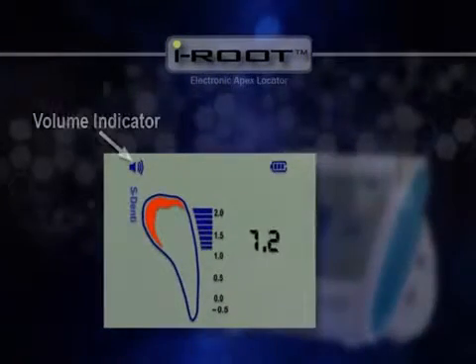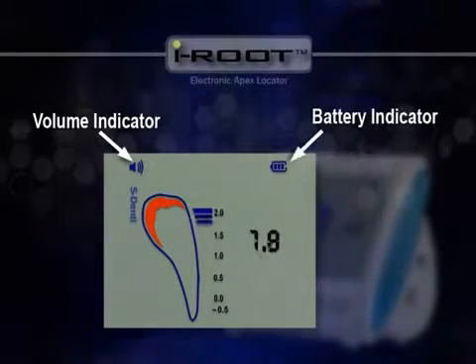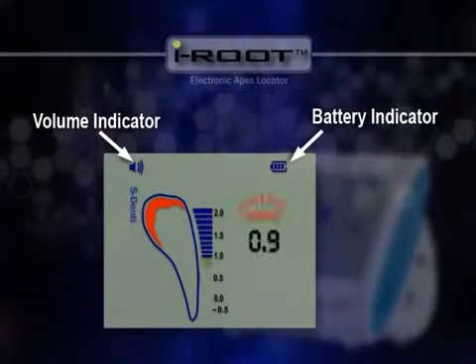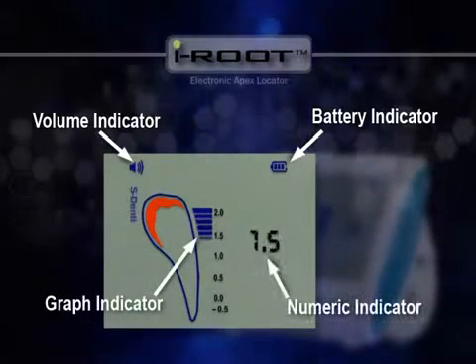Details on the LCD screen include the volume indicator on the top left corner, battery indicator on the top right corner, and the real-time progress of the file is displayed at the center of the screen.